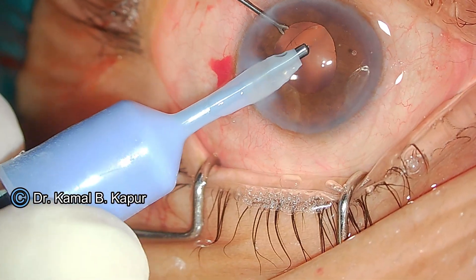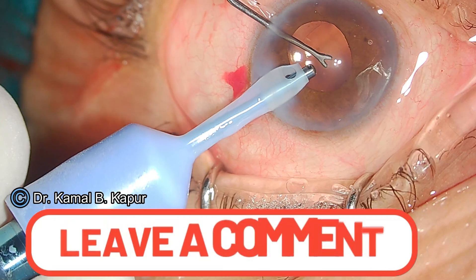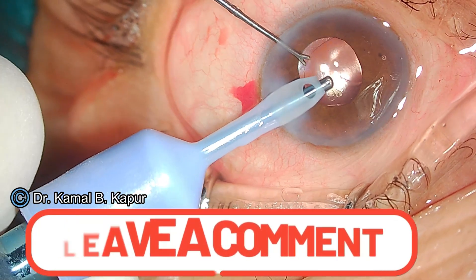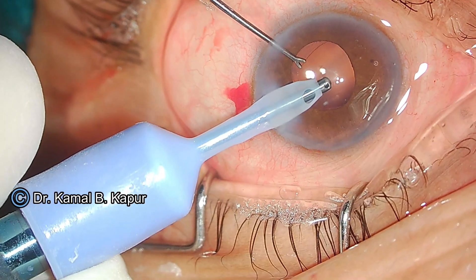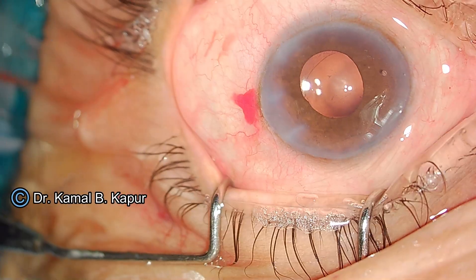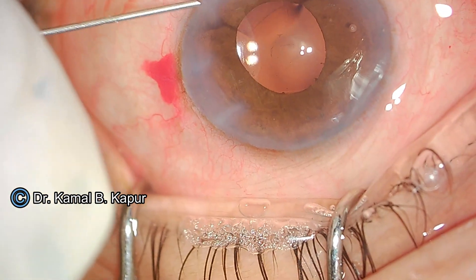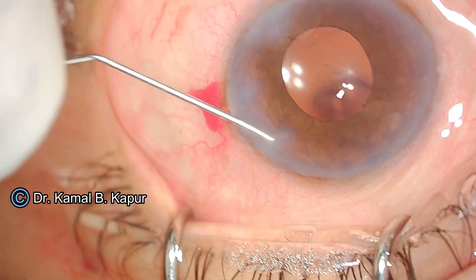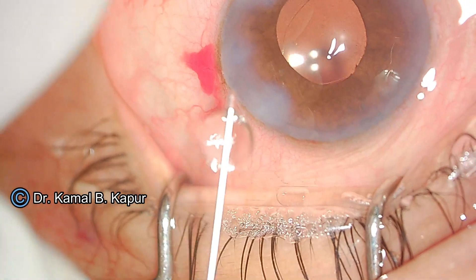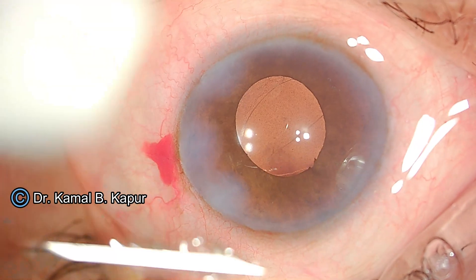This is a very meticulous surgery requiring steady hands. The positioning of the patient is very vital in this particular surgery. Any wrong positioning of the patient's head or the surgeon's hand can cause misfiring or wrong positioning of the stent. After the stent has been implanted, we perform gentle removal of viscoelastic and try to clear as much blood as possible, since any clots in that area can cause occlusion of the stent. We then make sure the wound is tight and sealed. The positioning of the stent can be checked on gonioscopy after a couple of weeks of surgery.